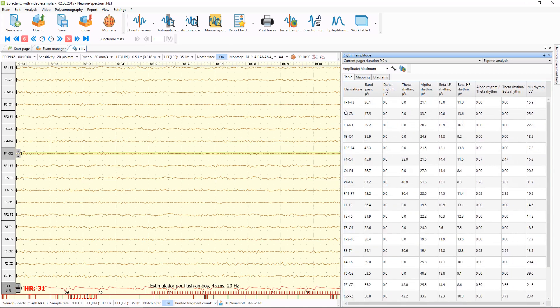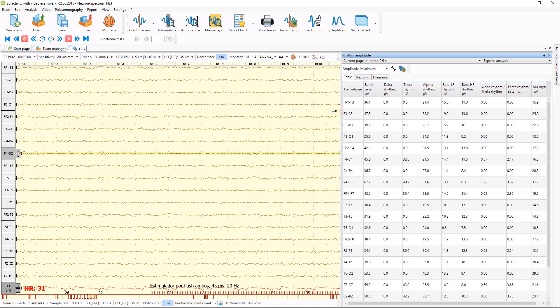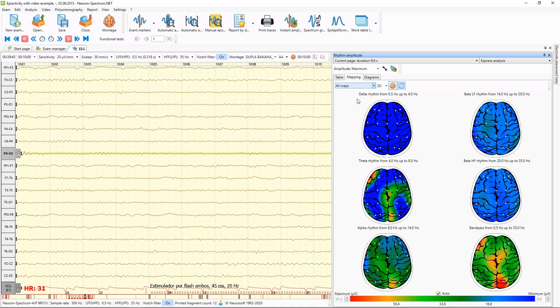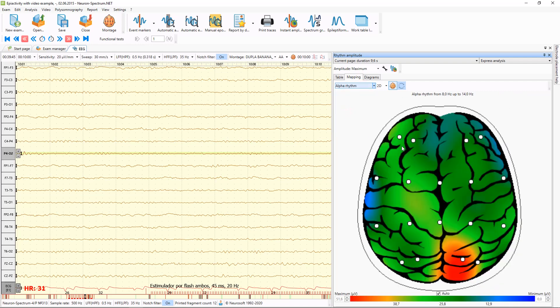In the amplitude analysis window, you can see the maximum, mean, and asymmetry of amplitude for each derivation. You can also review maps for all rhythms — Delta, Theta, Alpha — and select one of them to make it bigger. For example, according to this map you can see that the Alpha rhythm amplitude is higher in the O2 derivation.